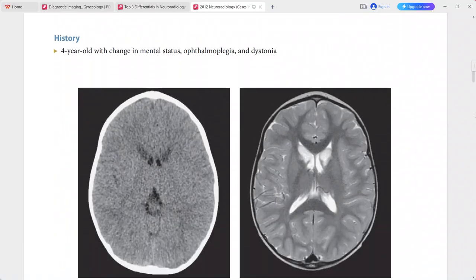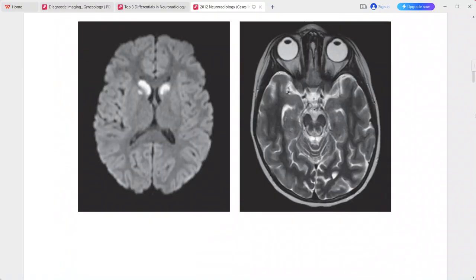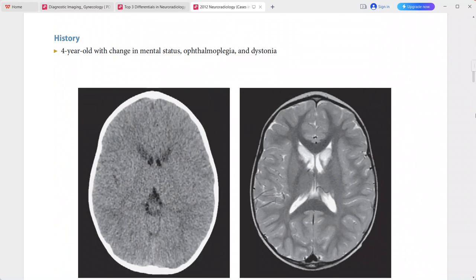Next: a 4-year-old child presenting with change in mental status, thalmoplegia, and dystonia. CT shows abnormal symmetric hypo-attenuation in the heads of the caudate nuclei bilaterally. T2-weighted MRI shows increased T2 signal in the same region, with restricted diffusion on DWI.